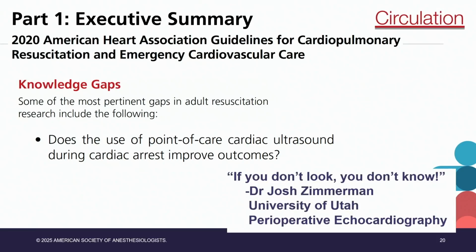However, if you know Dr. Josh Zimmerman from the University of Utah, if you don't, look him up. He's wonderful. And he always says, if you don't look, you don't know. I find it hard that I could complete a pericardiocentesis and get ROSC on a patient if I didn't actually do the ultrasound to see the tamponade in the first place to treat the patient.